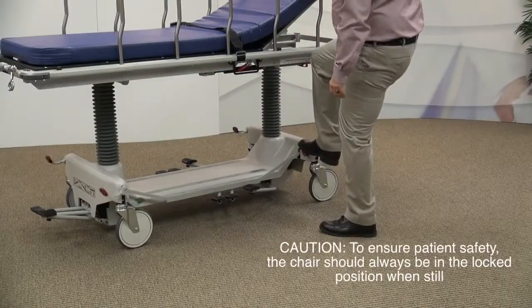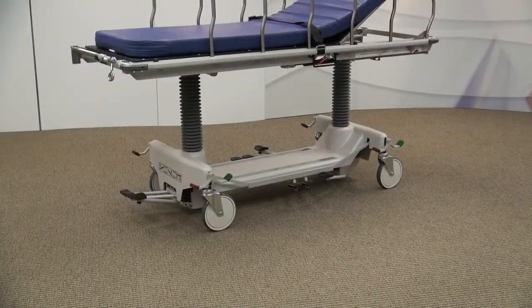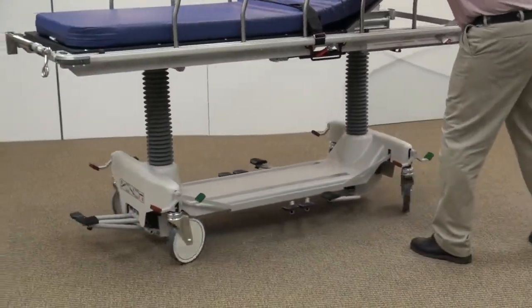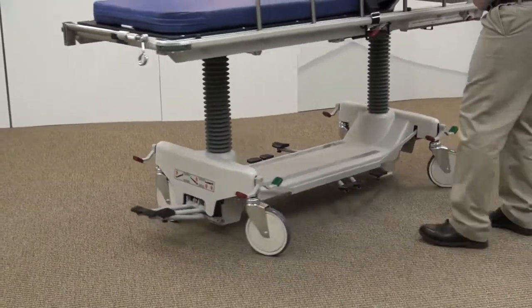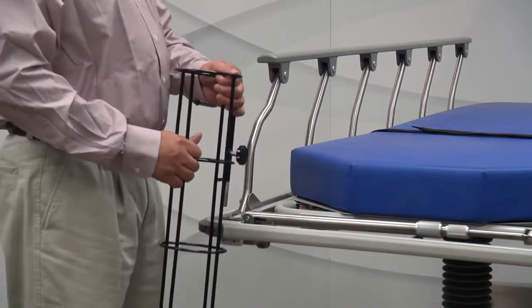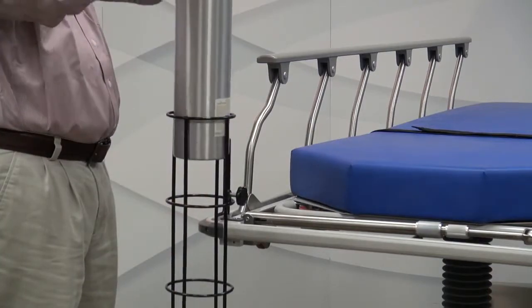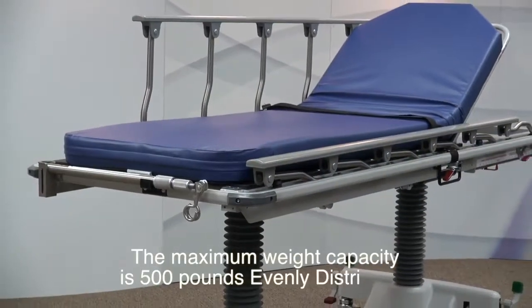Engaging the red pedal will lock all four casters. With the pedals parallel to the floor, the stretcher is in neutral, which will allow all four casters to pivot. The dual column base provides superior support for the stretcher. A vertical O2 tank holder can be installed to the base if needed. The Fluorotrack Stretcher has a maximum weight capacity of 500 pounds, evenly distributed.